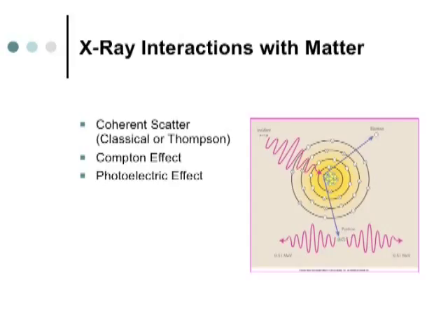As they relax, they release the energy, but the energy changes direction. So the fact that the X-ray has been absorbed and then released in a different direction, we call it scattered radiation. So it started out going one direction, and now it's going to leave the body in another direction. But the beautiful thing about coherent radiation, no harm to the patient. There's no ionization that takes place. It's simply heat. So it heats up the atom, and then it changes direction.